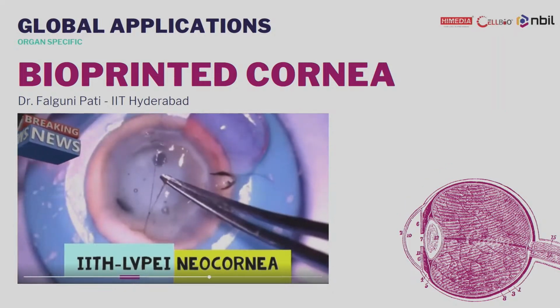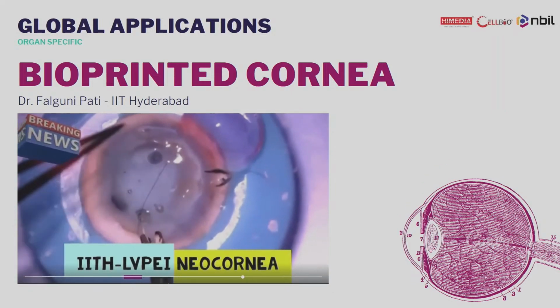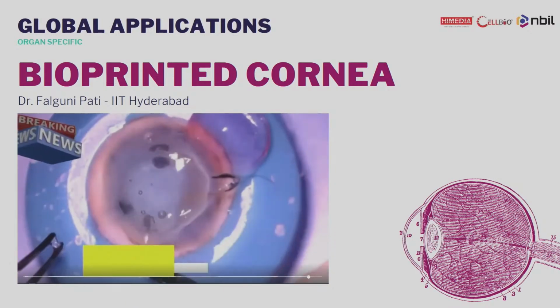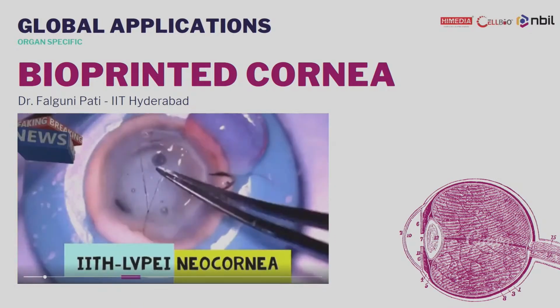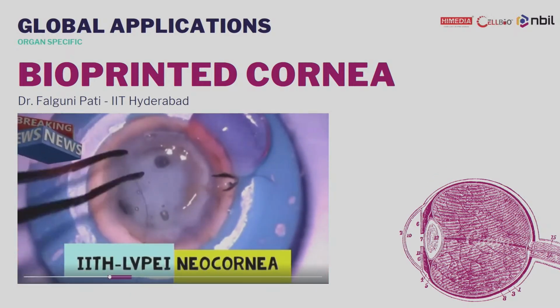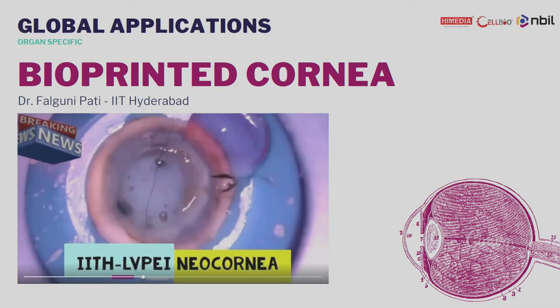If you see here, he is suturing it. Now, to get this suturing done, you need to ensure that the mechanical strength of the ink or the scaffold that you have post printing is strong enough to hold that stretch, that stress in itself.